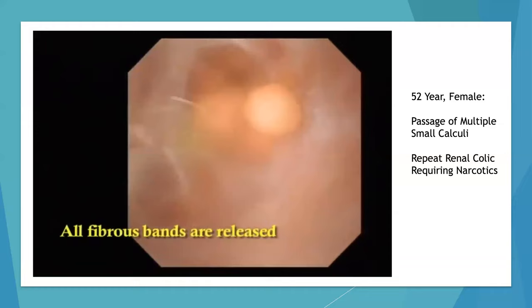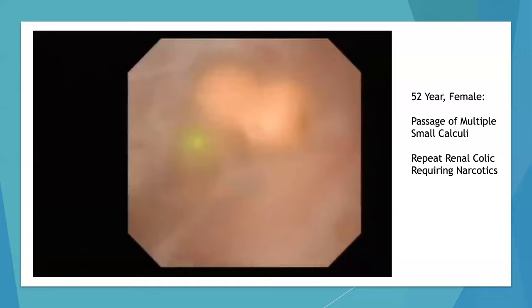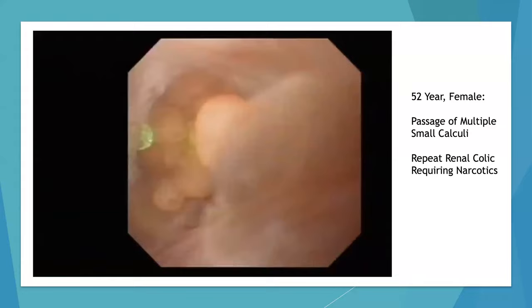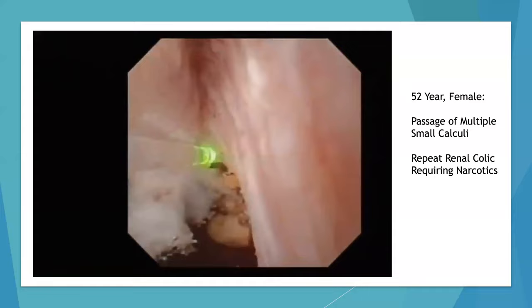The caliceal diverticulum was opened widely to ensure drainage. After extraction of the stones, a maximal attempt was taken to ablate the wall of the cavity.